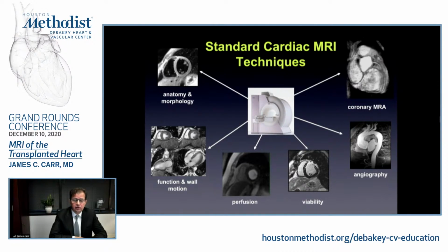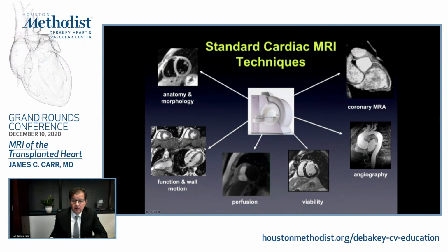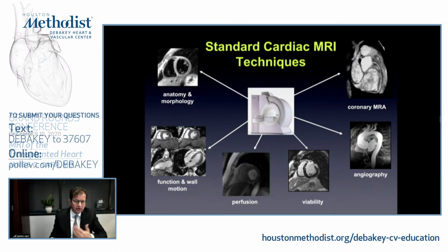study or protocol. So as many of you may know, MR is not just one single push button imaging test. It really utilizes multiple tests within a single test to evaluate different portions of any part of the anatomy, quite frankly, but particularly the heart. So we can look at function over here on the left, and we can look at what used to be called viability, but now late gadolinium enhancement. So this is kind of the bread and butter for cardiac MRI, and you use this routinely every day for looking at infarcts or heart failure evaluation, et cetera.